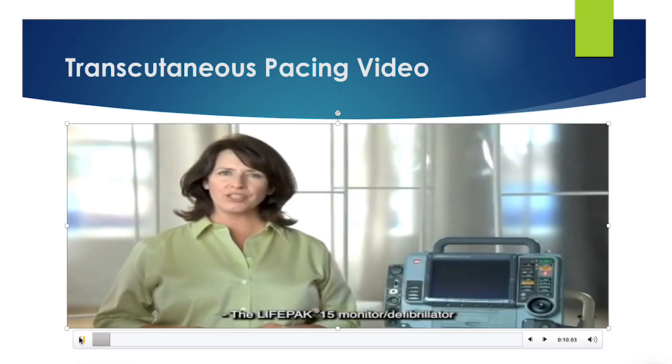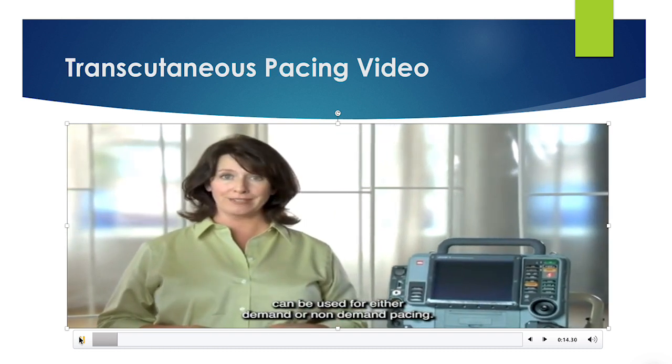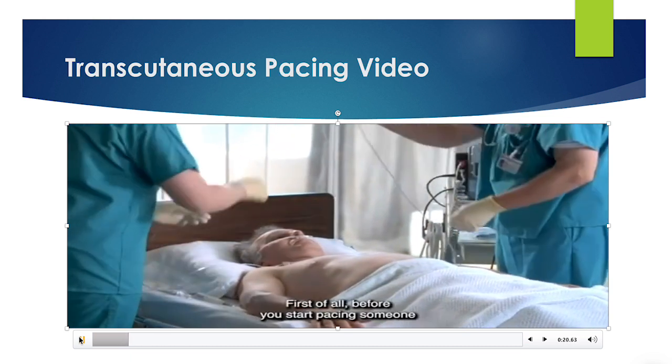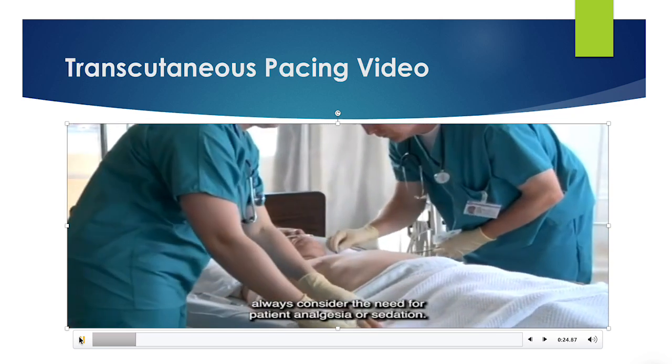The LifePak 15 monitor defibrillator can be used for either demand or non-demand pacing. Demand pacing is used for most patients, so that's what we'll show here. First of all, before you start pacing someone, always consider the need for patient analgesia or sedation.